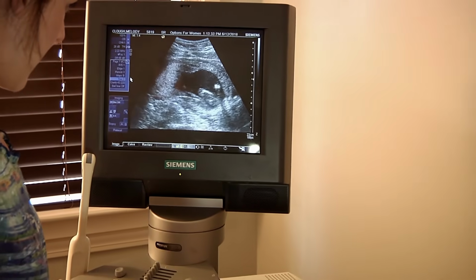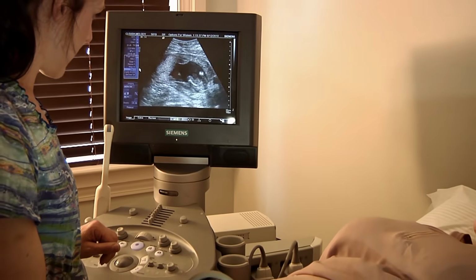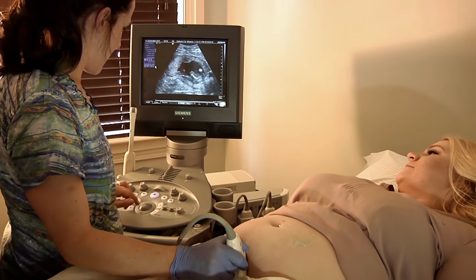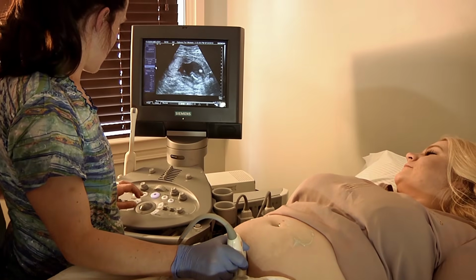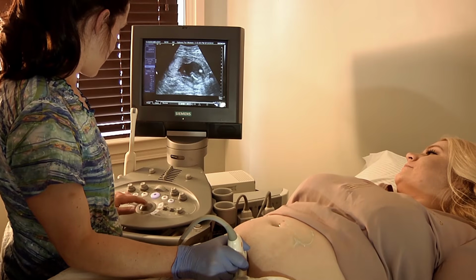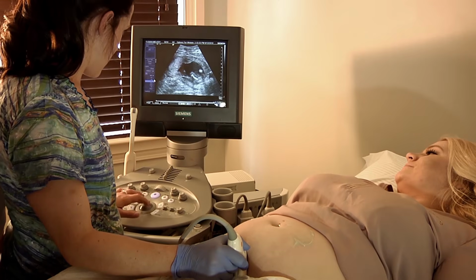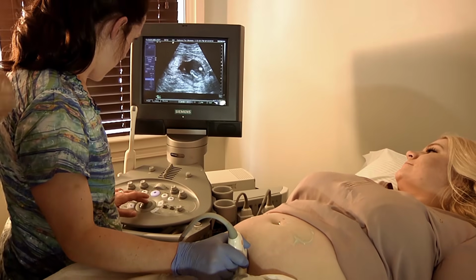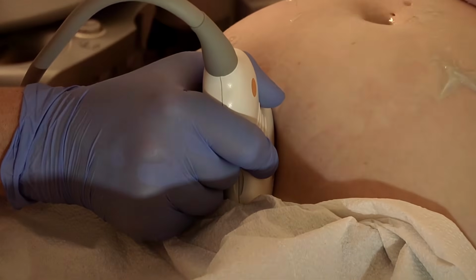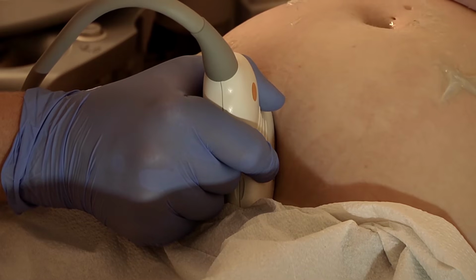Oh, there it is. We got to make sure we don't have the tib fib. I think right there. Freeze. Okay. What do you think? Do you think that's it? I do, because you're down by the butt and we traveled the road of the baby, so we know it's not humerus. We got down to the butt and there's one bone, not two, like you would see with the tib fib.